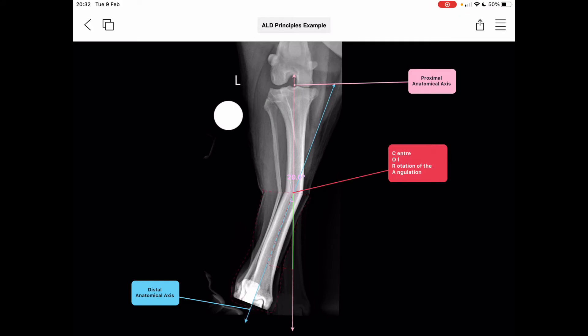Some initial points to note: we need a well-contrasted radiograph to easily make out our cortices and articular surfaces, allowing us to define our joint orientation lines and anatomical axes. We have a calibration reference point — in this case, a spherical marker of a known size level and adjacent to our area of anatomic interest. We also need a well-positioned radiograph. An anatomic axis is a line that precisely bisects the medullary cavity of a straight portion of bone, or the best fit of that part of the bone.